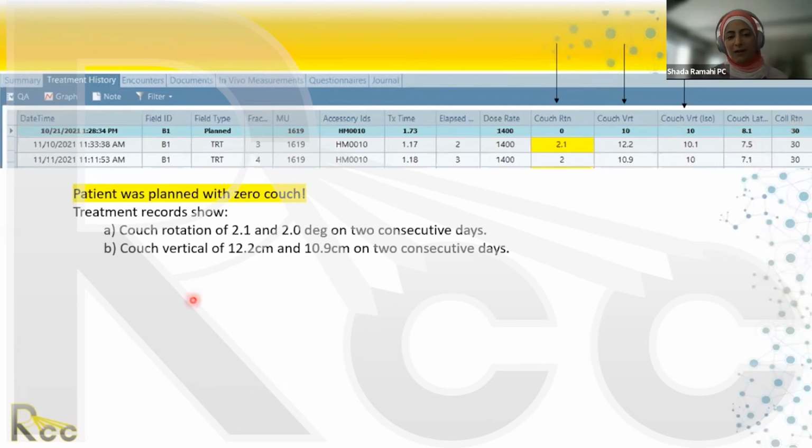So now the question is, how much do we accept before we go back and realign the patient? I don't know, we love our therapy partners, we love our radiation therapists, but between us there's a kind of hostility, we go head to head. We have seen, and this is very recent, about a year ago, we have seen 5 degrees of rotation, we have seen 7 degrees of rotation on the couch, and then we treat.